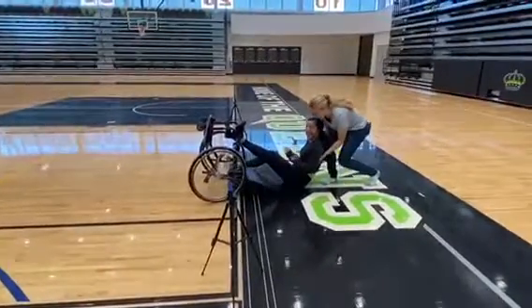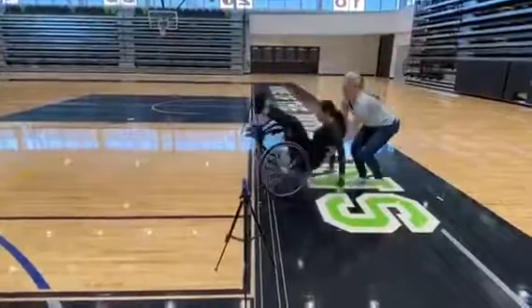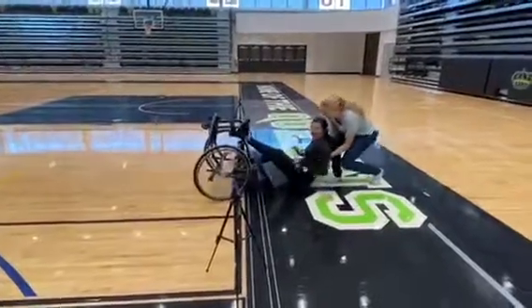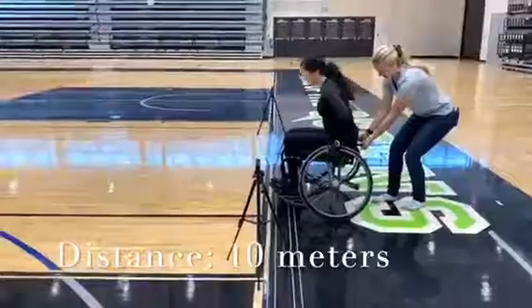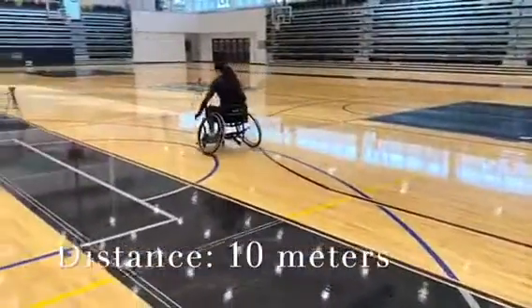Unfortunately, we won't have any spotters, so on the day of the test, we will make sure that we have wheelchairs that have the extra third wheel behind to avoid tipping over. Once you have all the required equipment, you will need to first measure out the 10 meters in distance and label the start and the finish with a piece of tape.